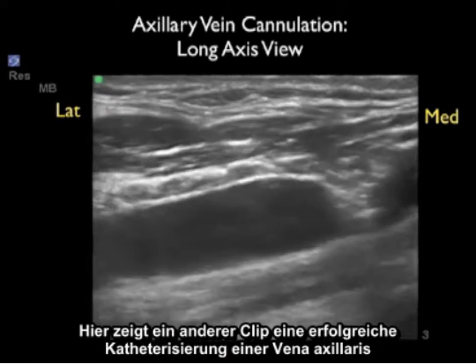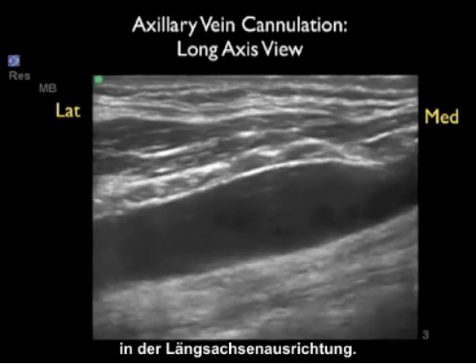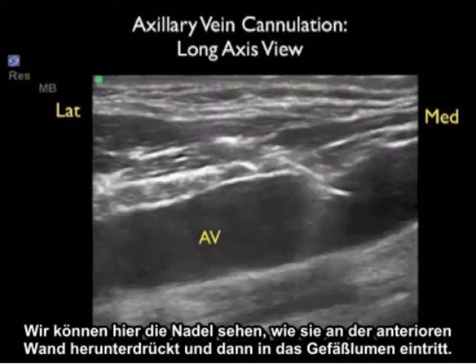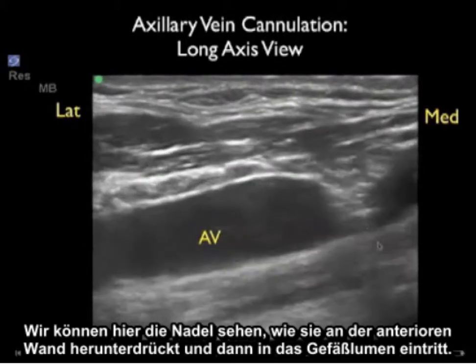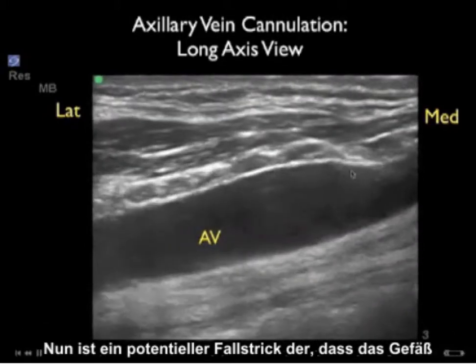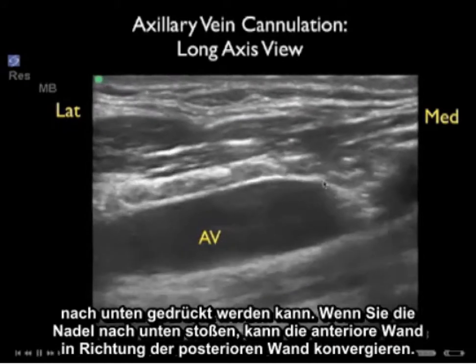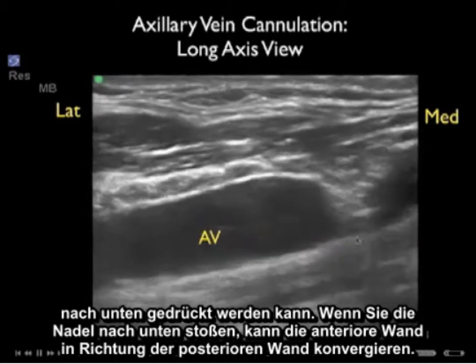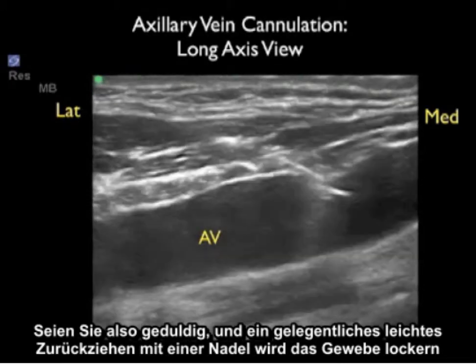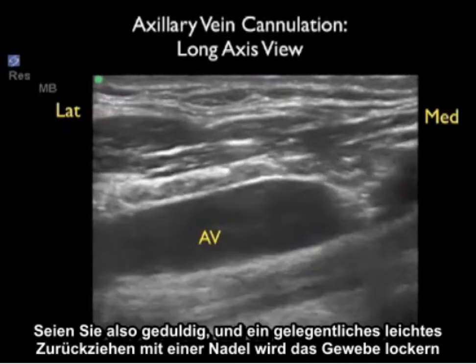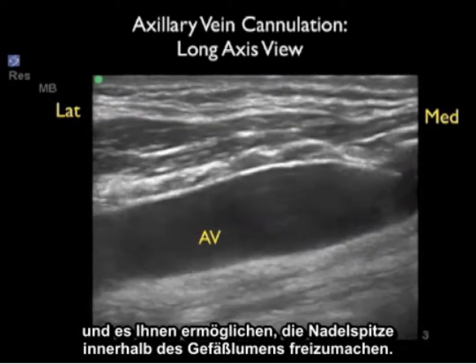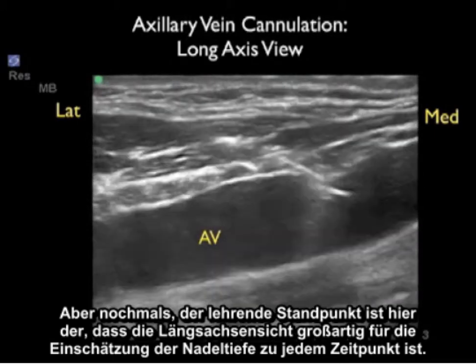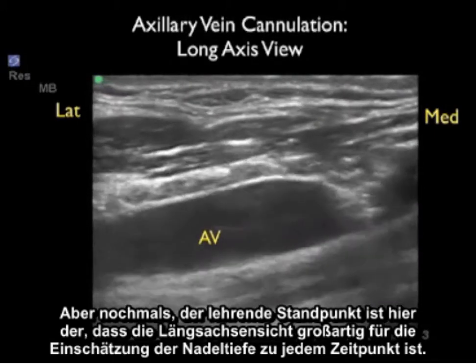Here's another long axis clip showing a successful cannulation of the axillary vein — we can see the needle pushing down on the anterior wall and then entering the vessel lumen. One potential pitfall is that the vessel can be pushed towards the posterior wall as the needle advances. Having patience and occasionally pulling the needle back slightly will loosen the tissue and free the needle tip into the vessel lumen. The key teaching point is that the long axis view is excellent for assessing needle depth at all times.